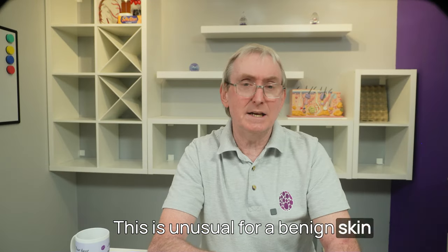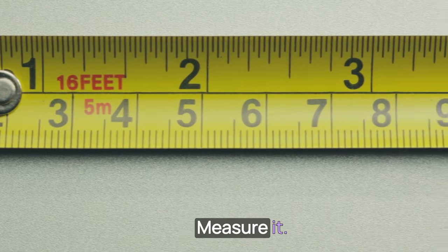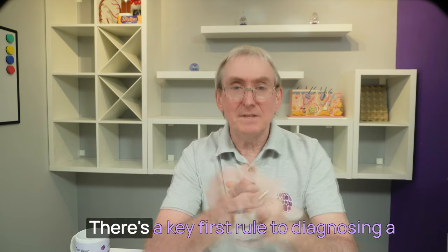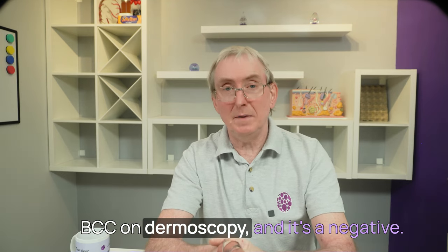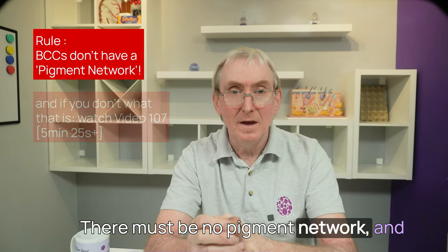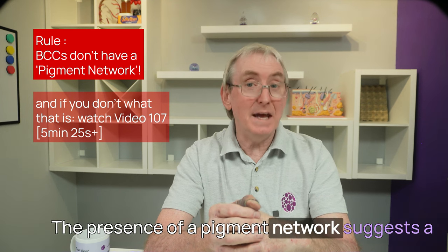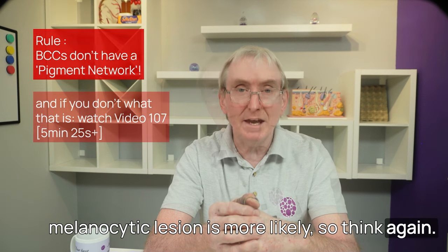Note the lesion's location, measure it, and feel it — is it firm or soft? Then have a guess at what you think you'll see on dermoscopy. There's a key first rule to diagnosing a BCC on dermoscopy, and it's a negative: there must be no pigment network. If you see one, it's unlikely to be a BCC. The presence of a pigment network suggests a melanocytic lesion is more likely, so think again.